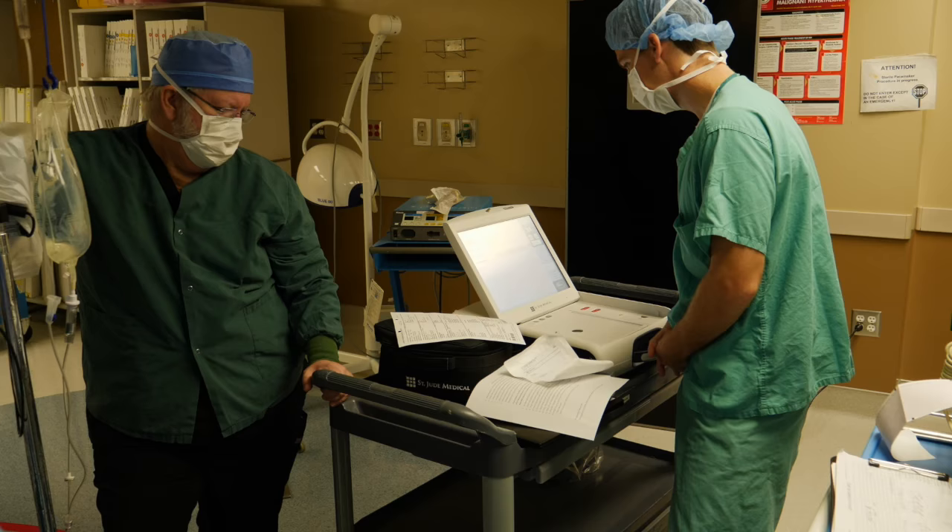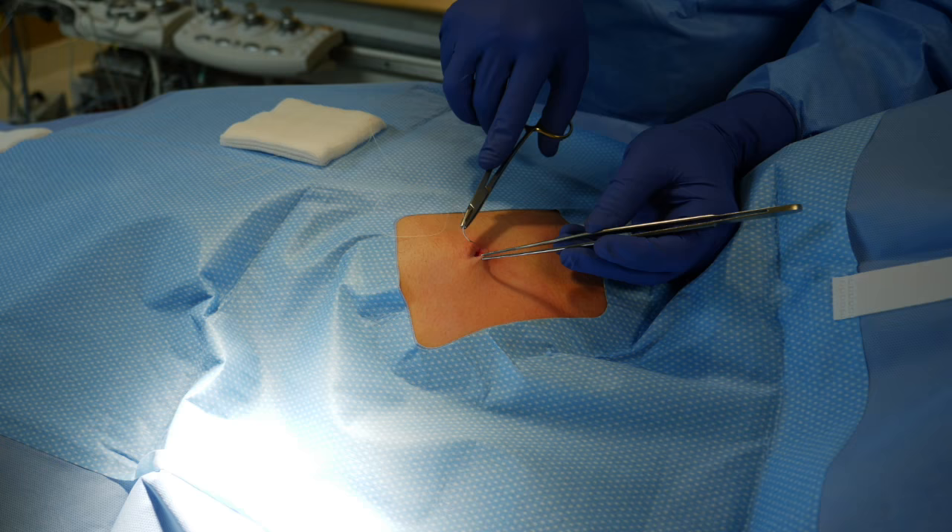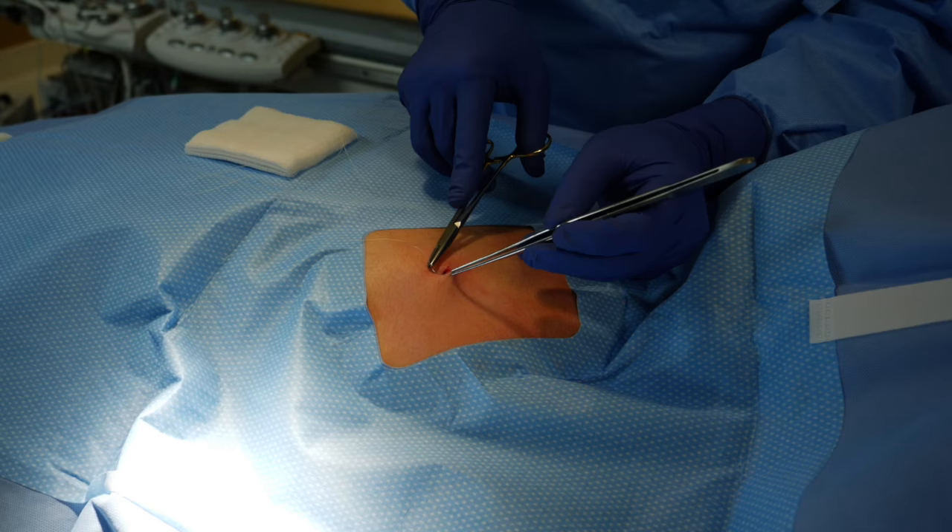Here's our technician confirming adequate sensing of the heart rhythm signal. Excellent sensing from these devices — every beat of the heart captured starting now. There's the electrical signal that's recorded. We can program that device to meet the specific needs of our patient.